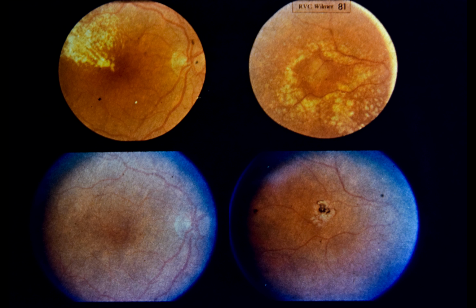Lesions of moderate intensity utilizing a beam diameter of 200 microns were delivered to the macroaneurysms. Lower left is a photograph of the macula 4 years after photocoagulation, at which time visual acuity was 20/20. Lower right is a photograph of the photocoagulation scar. The patient has been asymptomatic for 4 years.